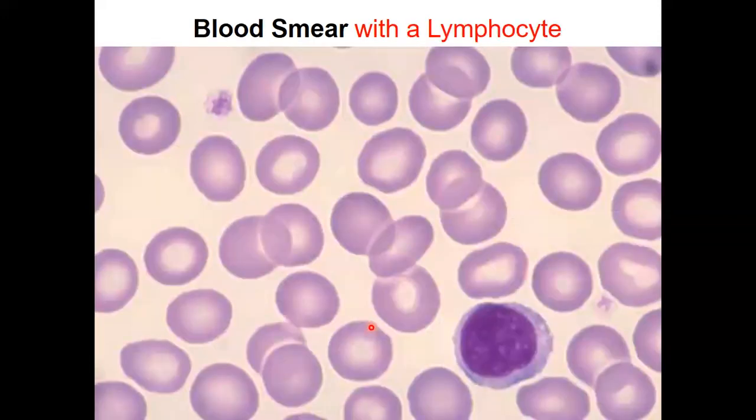Next we look at the lymphocyte. Now, we're saying lymphocytes are small. In terms of size, lymphocytes are closer to the red blood cells. Apart from that, lymphocytes are a bit larger than red blood cells, and they stain darker than red blood cells. Red blood cells are pinkish, but these will be purple and bluish in terms of stain.